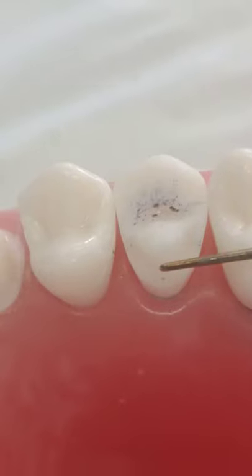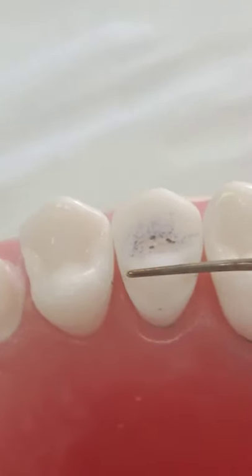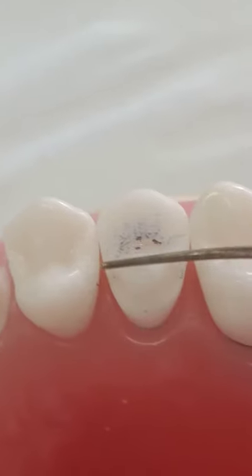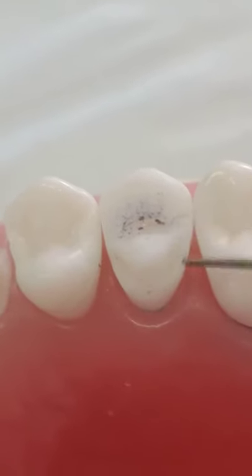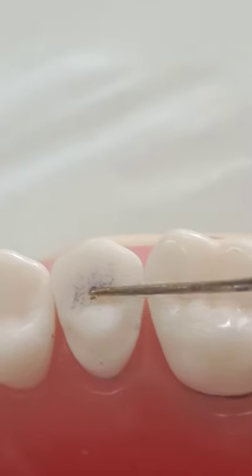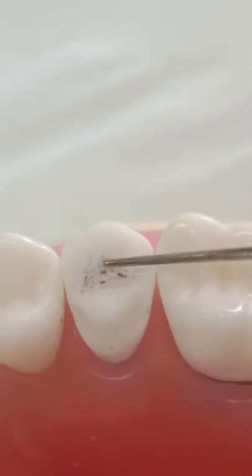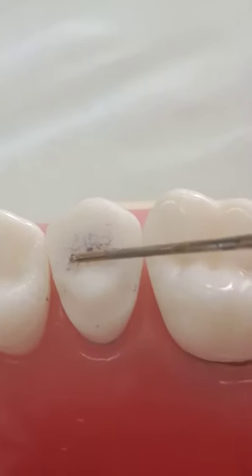Less than two millimeters from your finish line. Proximally, you have finished in a correct way — I can see the contact areas intact as they were before. Excellent. The foundation here is excellent, very smooth.